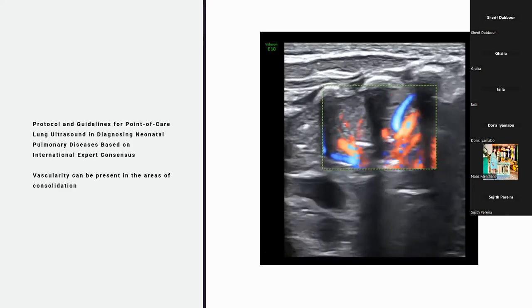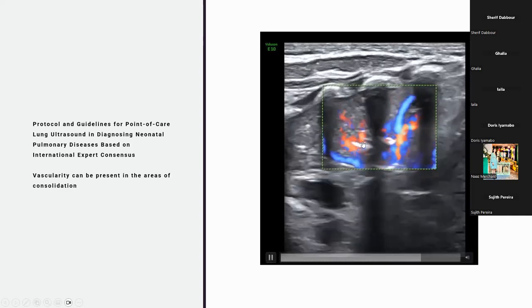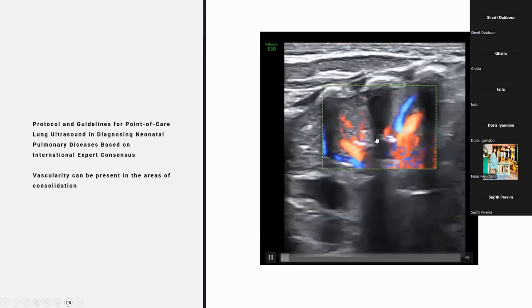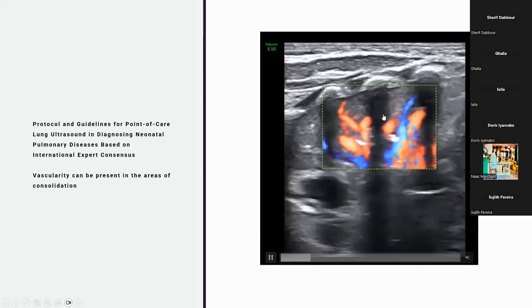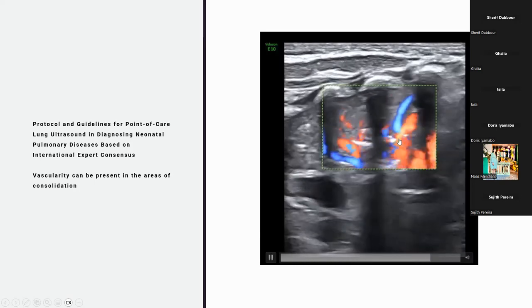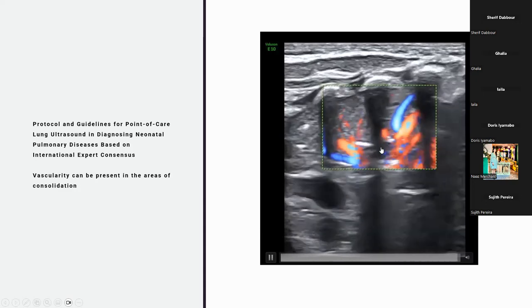And you're seeing air bronchograms, which are dynamic and static? Static, more likely. Do you see a lot of dynamic air? Maybe they're in one position coming in and out, and they're parallel to each other. Yeah. So what do we do here? What do you think your diagnosis is?